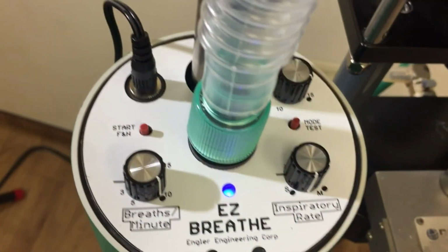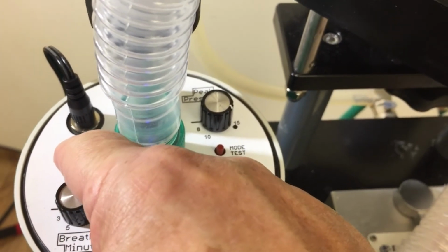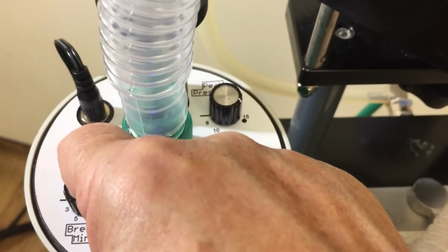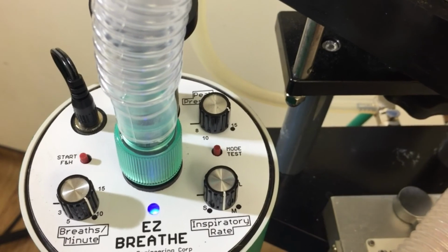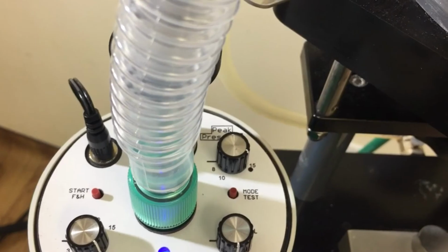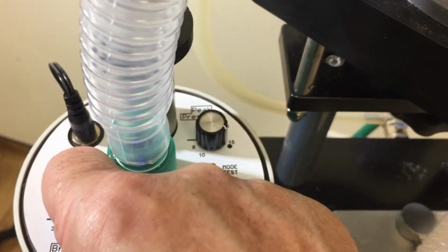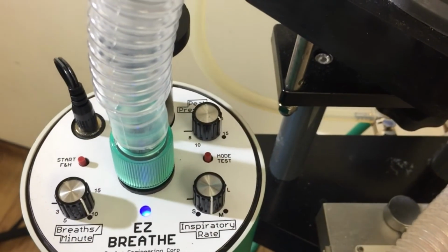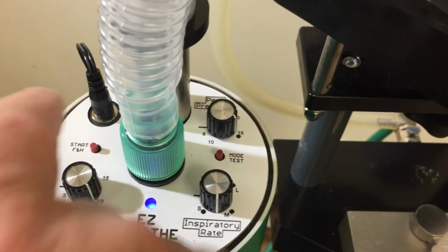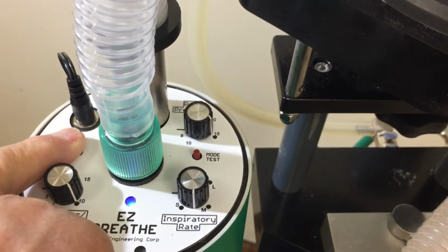Fill and hold has several other functions. One is to give the patient repeated deep breaths. Press it, hold, release. Press and release. This can be used to get your patient quickly under anesthesia. Note that if we turn the ventilator on and it's cycling, you can still do fill and holds. Press, release. The ventilator will take over once you've released. Fill and hold can also be used to test the integrity of the endotracheal tube cuff.